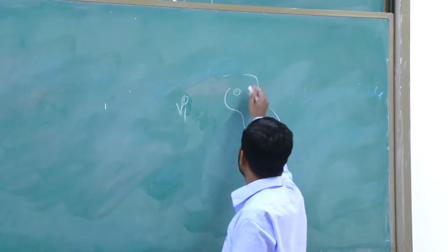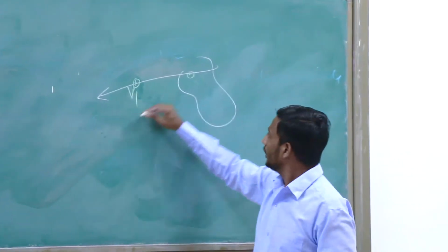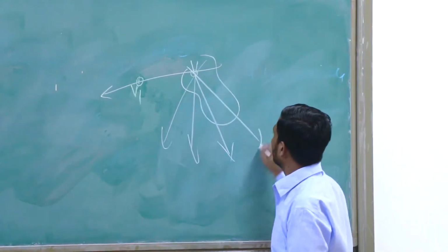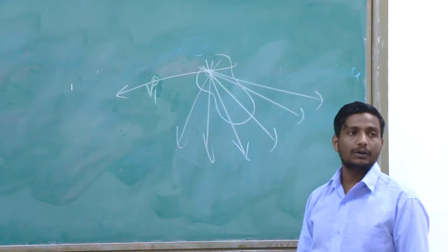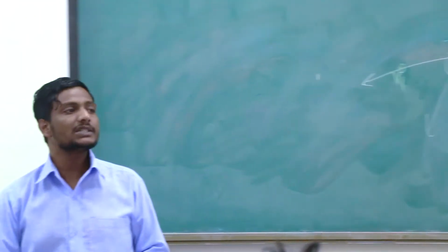The axis of these electrodes goes from negative to positive. If I put all the chest electrodes here, the axes will be formed something like this, up to V4, V5 as well as V6. This is just one idea. These are the different axes of our chest electrodes, and they give rise to the leads. We call them chest leads.